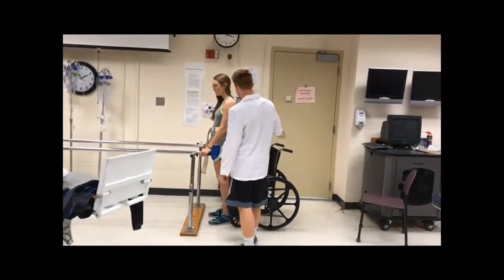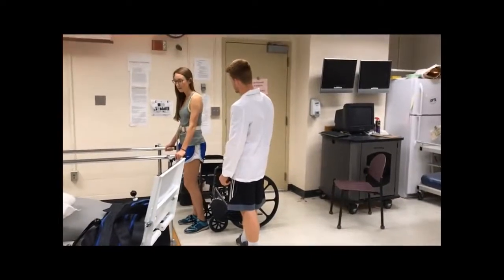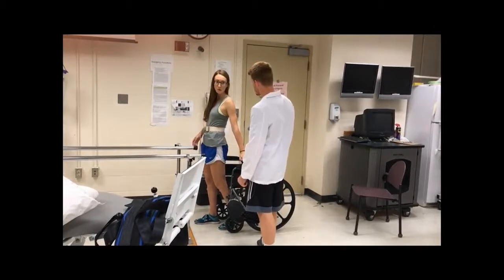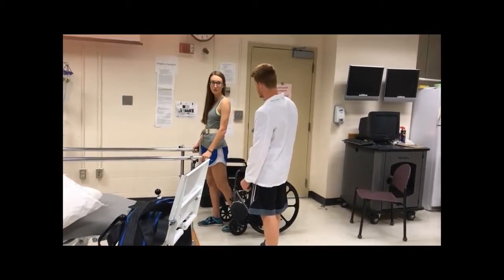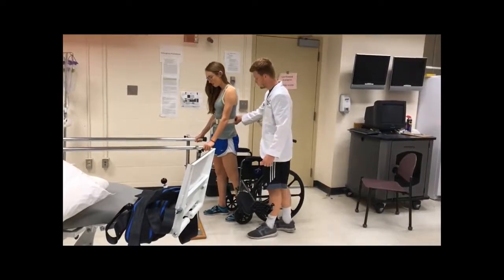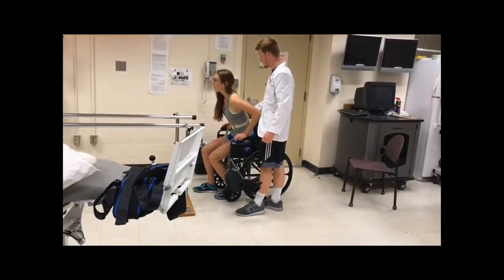Okay Joanna, so before we sit, can you repeat the instructions back to me? I'm going to take my leg and put it back against the chair, then reach back with one hand and lower myself and let go of the bars with the other hand. Okay, so I'm going to guide you. Reach back with your left, slowly, and then with your right.